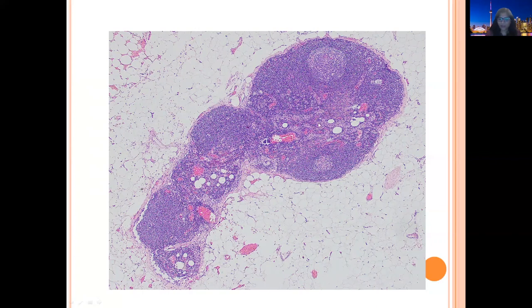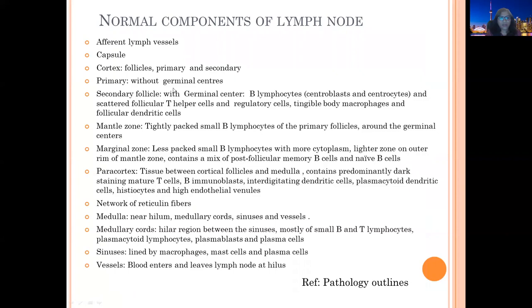Primary follicles are without germinal centers. Secondary follicles have all these mixture of cells. The mantle zone is tightly packed small B cells outside the primary follicles and around the germinal centers. The marginal zone has less packed small B cells with more monocytoid appearance and contains a mixture of post-follicular memory B cells and naive B cells. Paracortical tissue is predominantly composed of mature T cells, along with B immunoblasts, interdigitating dendritic cells, plasmacytoid dendritic cells, histiocytes, and high endothelial venules. In the medulla there are medullary cords with a mixture of small B and T cells, plasmacytoid lymphocytes, plasmablasts, and mature plasma cells.